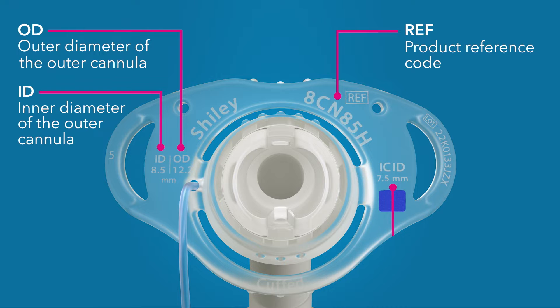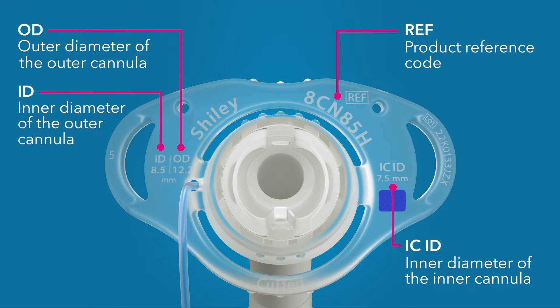The inner diameter measurement of the inner cannula appears on the right side of the flange, and the cuffed or uncuffed designation is etched on the bottom of the flange.